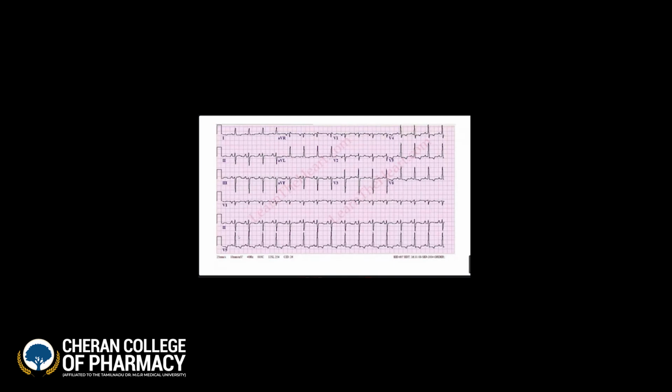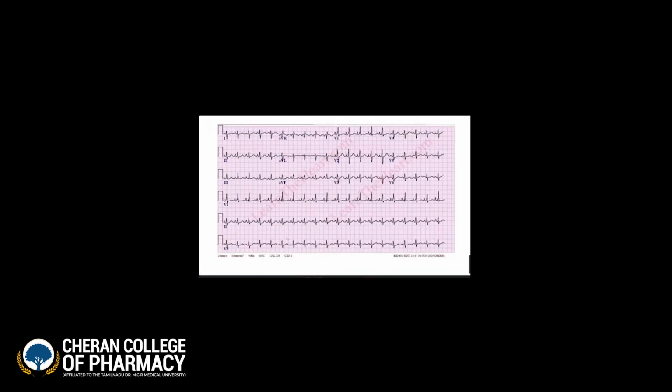This is the pattern. Look at my finger. Here it is a consistent gap, and afterward it is getting delayed; the gap is getting enlarged, increased. So this is an irregular pattern. After looking at this ECG, you come to know that this is a consistent gap. Here from V5, see this R to R interval, the gap is consistent. That means the rhythm is regular.